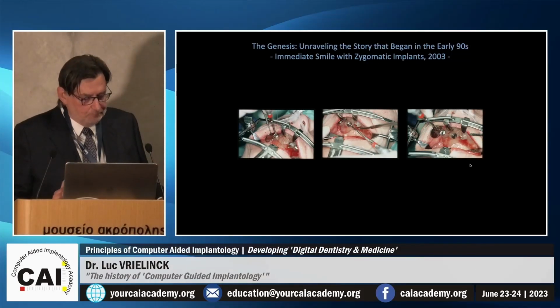But if you imagine, the pterygoids go to the back, the zygoma goes lateral, and the other ones are vertical. So you have all directions for drilling, so it was not possible to make this in one drill guide. We made 2 drill guides for this patient, one for putting 3 zygomas and one for putting 4 standard and 1 zygoma. So we looked a little bit at how we could drill it. And you can immediately see that the directions are completely different.